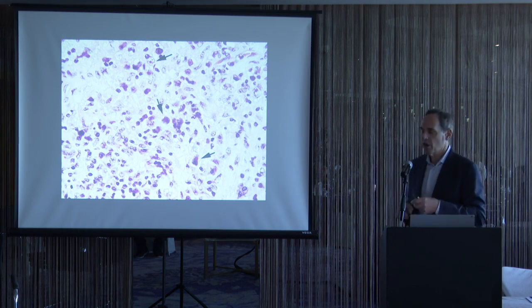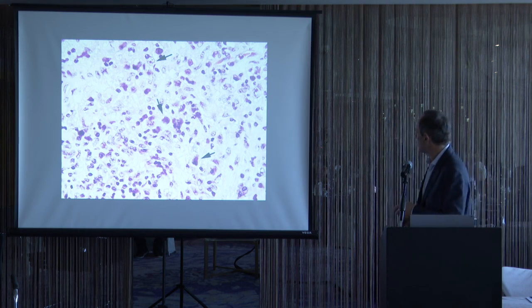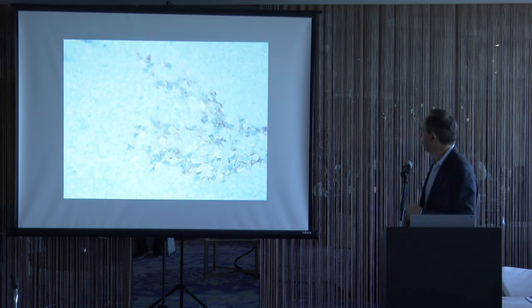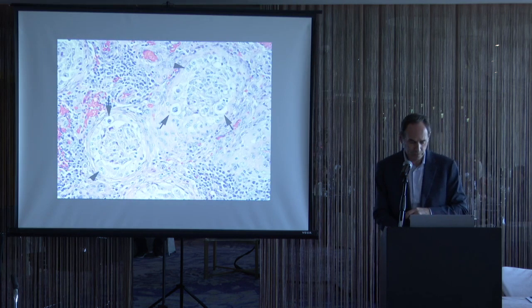And so it's very common for seminoma cells to undergo this pyknosis or very hyperchromatic smudgy chromatin, which are not going to be the same as what one would think of as a classic seminoma cell, but these are seminoma cells you still have to be able to recognize. Here, if you do a C-kit, for example, you can highlight the seminoma cells amongst this very prominent granulomatous inflammation.